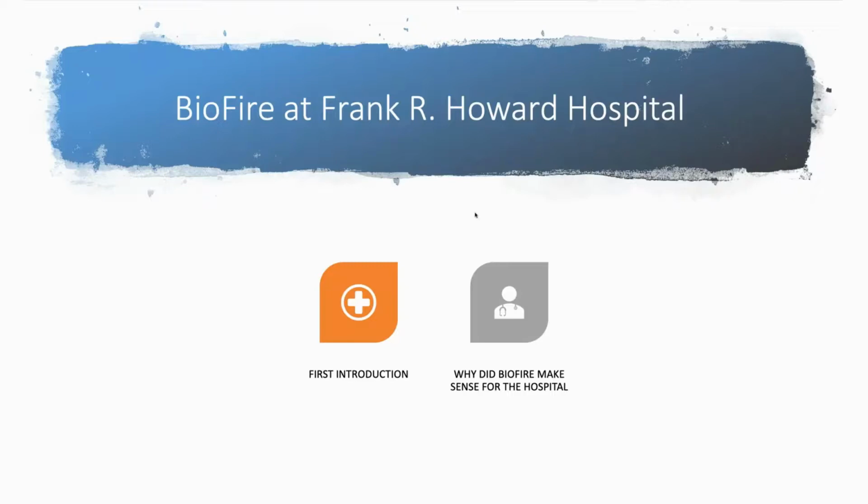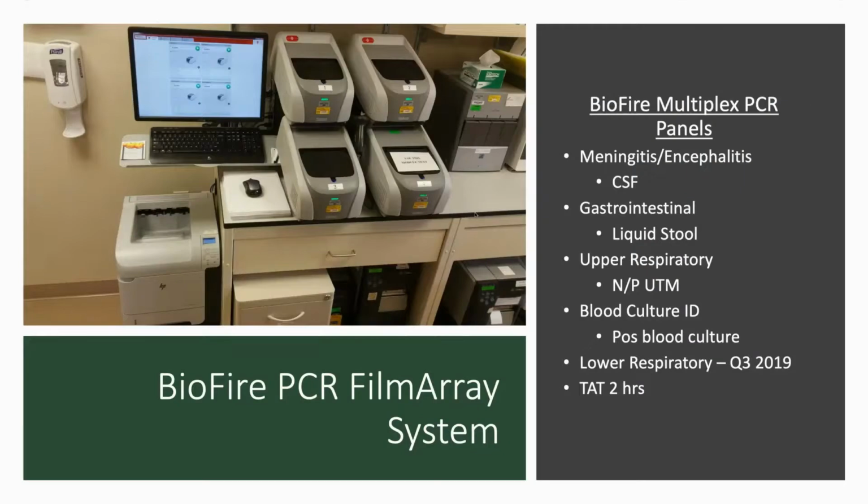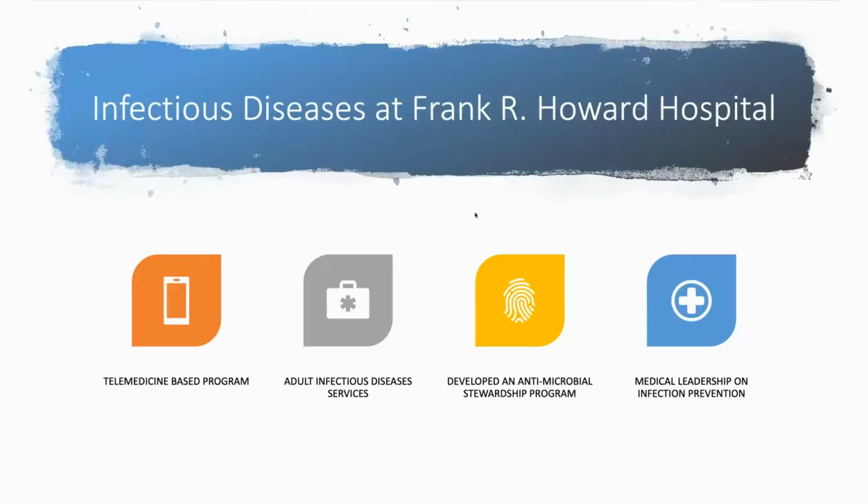You're absolutely correct. I didn't mean to interrupt you. Being a clinician practicing at that hospital, I'm probably going to lead that revolt. So again, here's that BioFire system and the multiplex PCRs we were talking about. You continually say you engage the providers and you ask them what they wanted. I think that is such an important tool and something that we need to do a lot more of, that connection between laboratory and clinical services.